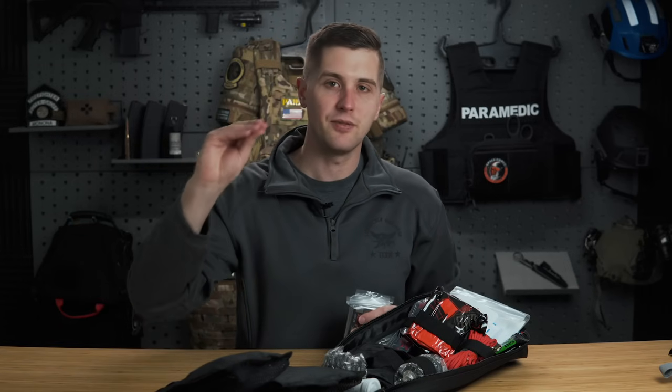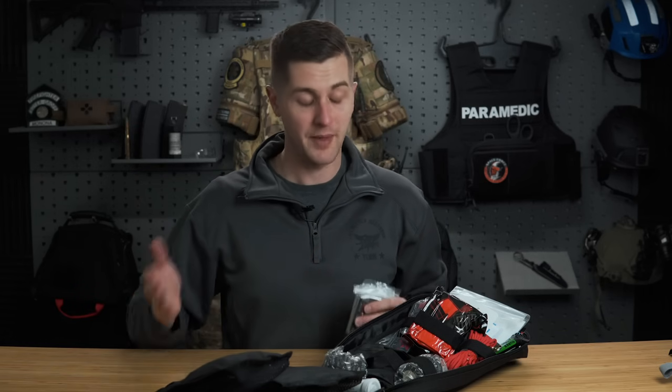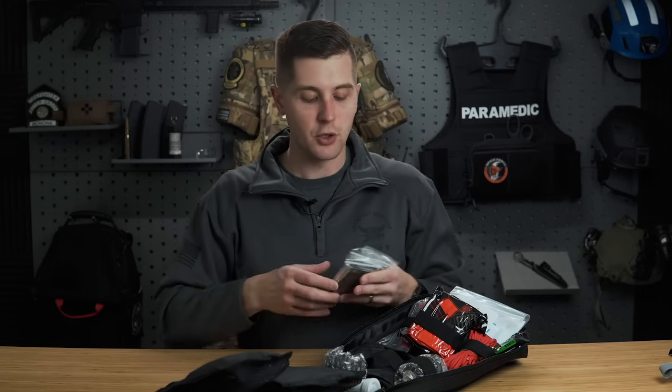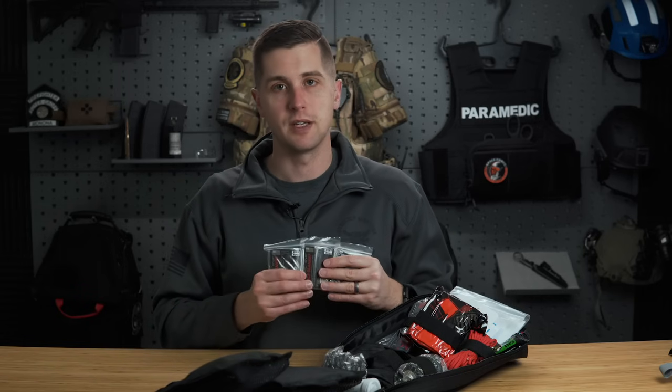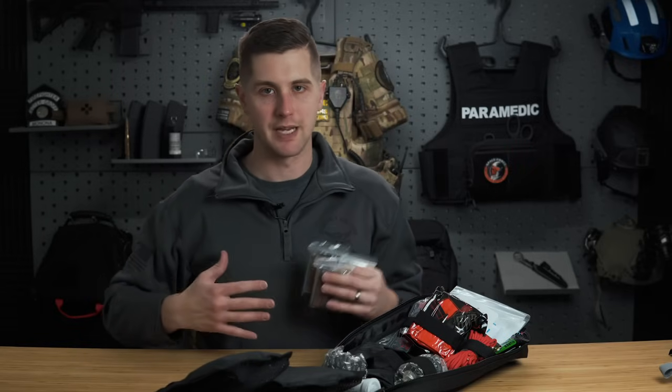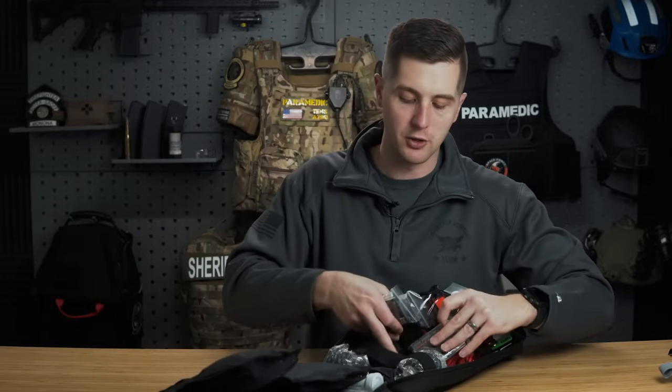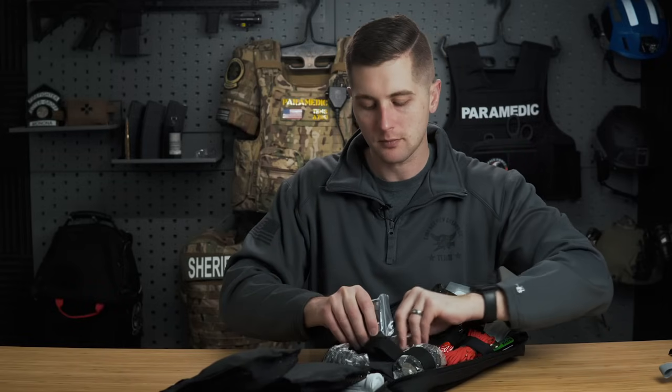They become what's called poikilothermic, which means they take on the temperature of the environment. Even if it's 95 degrees outside, we all think that's super hot, but that is actually the temperature where platelet dysfunction starts to happen, and they will start bleeding a lot more. So keeping them warm is a hugely life-saving intervention. Just know that this on its own isn't enough to keep them warm. Bundle them up in whatever jackets, coats, blankets they have, and then use this as the outer protective layer, and you'll be in a much better space for that patient.